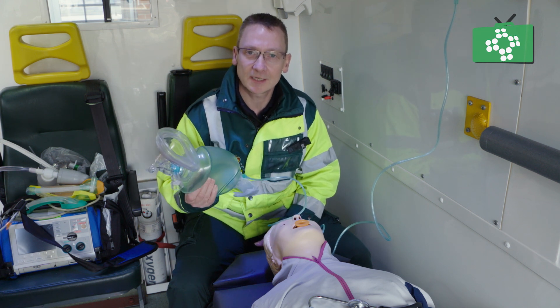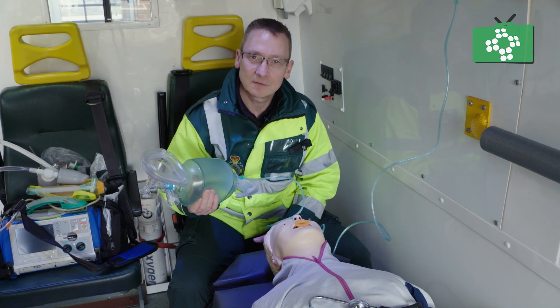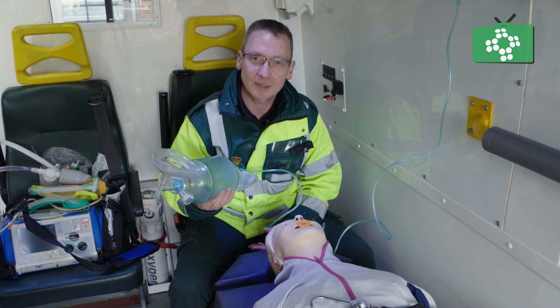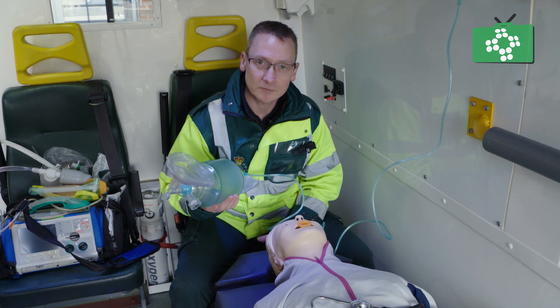We don't suddenly take a gasp — we breathe gently in and exhale slowly, and this we should replicate when we are ventilating our patient's lungs.